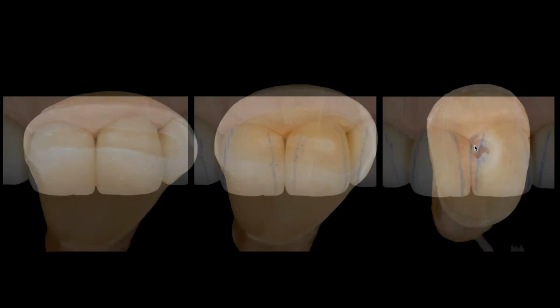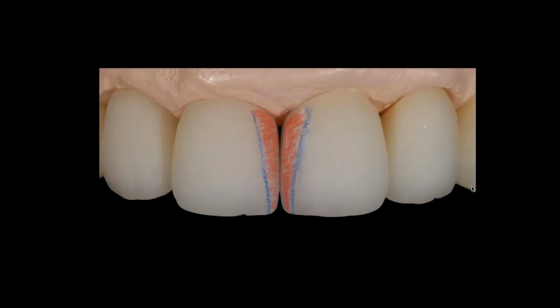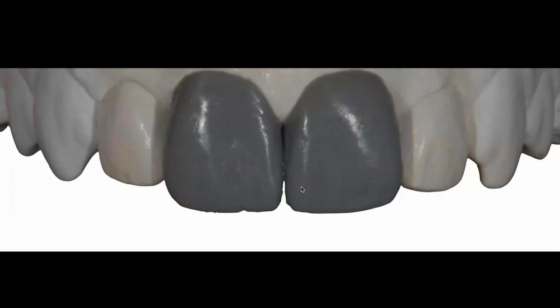So even when we think we got it, a lot of times we don't, right? I remember working on this case years ago, and I just quickly put my blue lines on. I'm like, oh yeah, I'm pretty close. And then I'm like, well, wait a second. This looks a little off. And then when I fill in my red lines to see where that emergence is in the real volume, I can see how much different that is. So I got to kind of come back and correct that. And I'm either going to have to take away more here, or maybe add something back here to get these to look the same, because those are the areas that I care about the most.